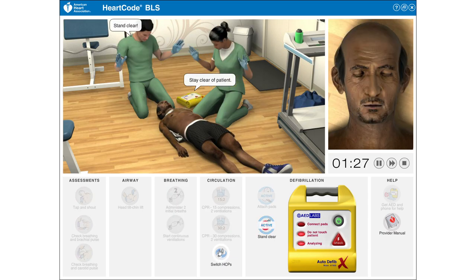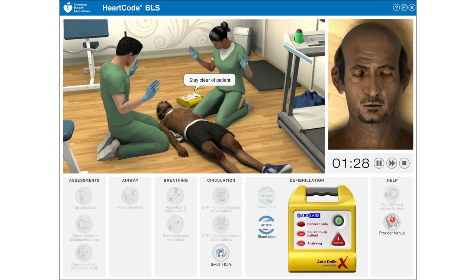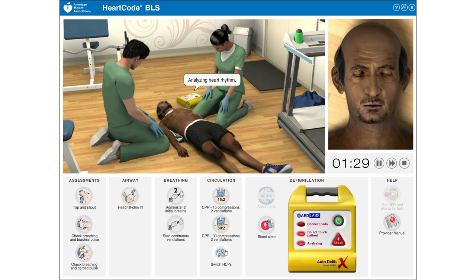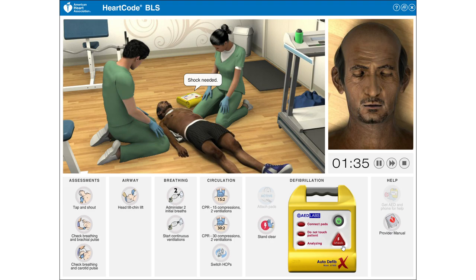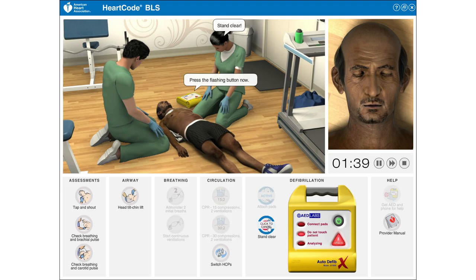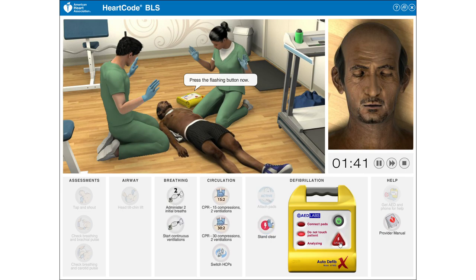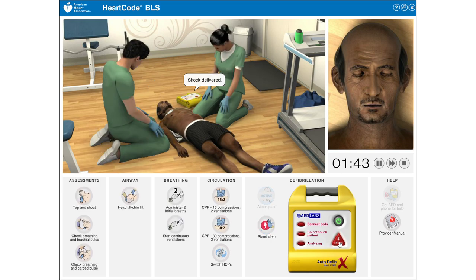Stand clear. Stay clear of patient. Analyzing heart rhythm. Shock needed. Charging. Stand clear. Press the flashing button now. Shock delivered.